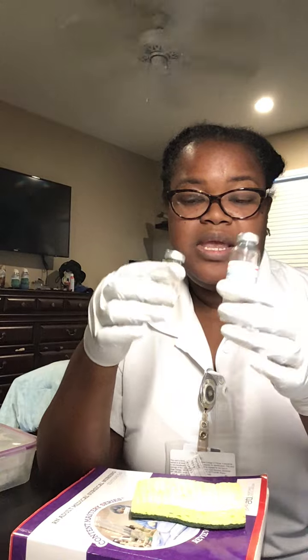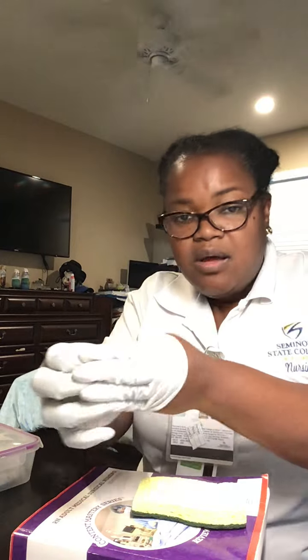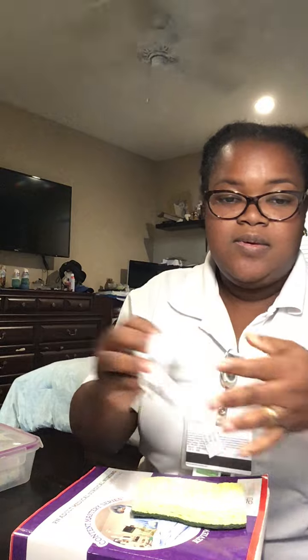She maybe later on can use that again or another patient can use that. I take off my gloves. Okay, I put these back in their positions.